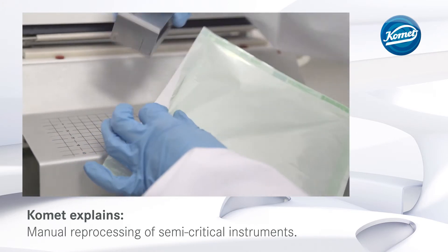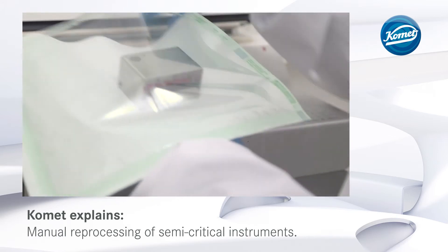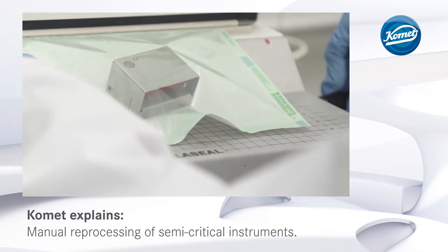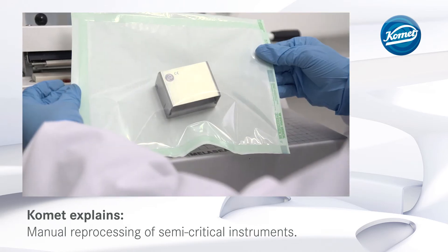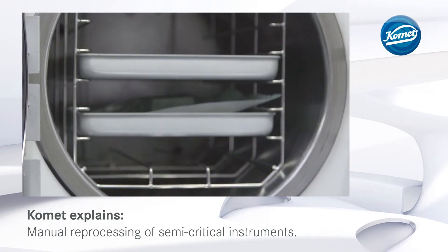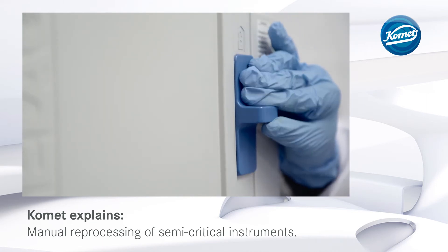After manual processing, semi-critical instruments have to go through an additional sterilization cycle. The instruments are sealed in sterilization film. Make sure to adhere to the instructions provided by the manufacturer of the sterilization film, especially regarding the weld seams. The instruments are then sterilized. Check if the sterilization has been completed successfully and document the results.